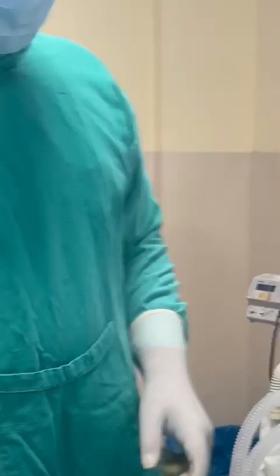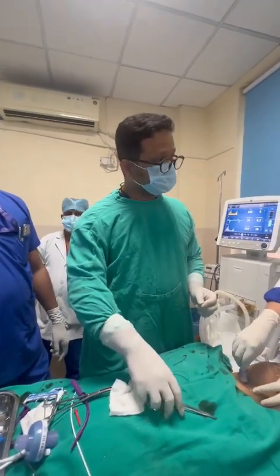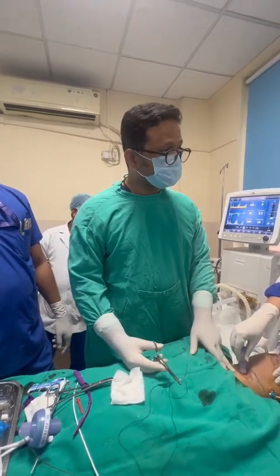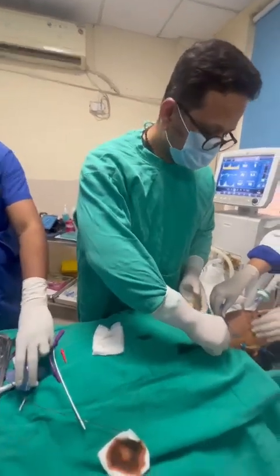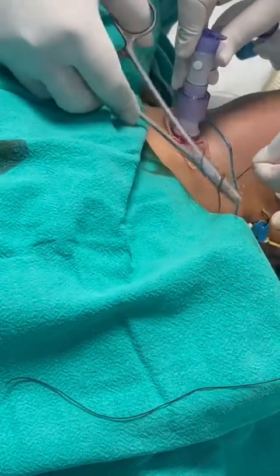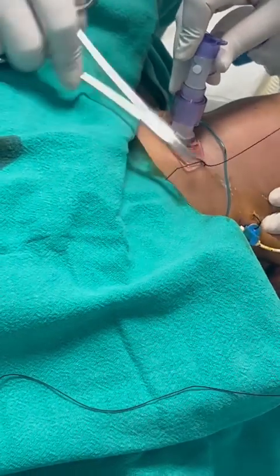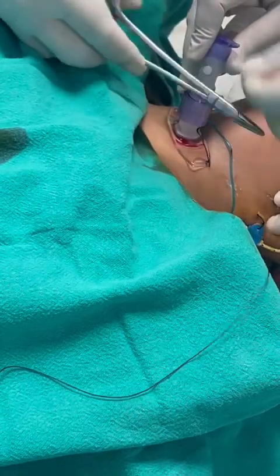Yeah, of course. In the last case, you remember the lady Anuradha, she had gone into the thyroid gland. She had so much vascular thyroid structure. In fact, there was a possibility we may have hit this one, but she bled mainly because of other reasons, not per se the injury, because she already had some supraglottic injury beforehand. Arterial bleed is difficult to stop unless you either ligate or cauterize them.